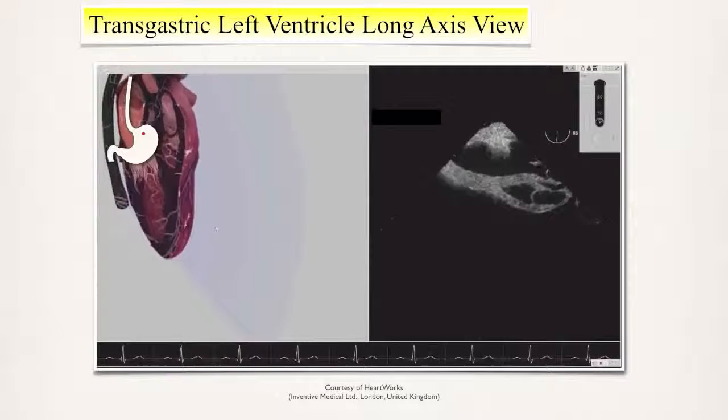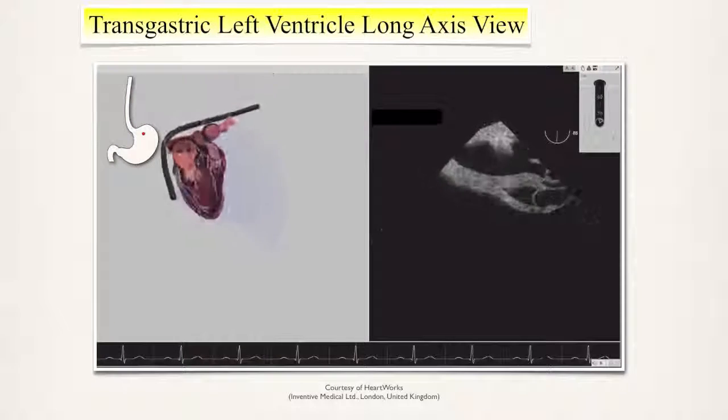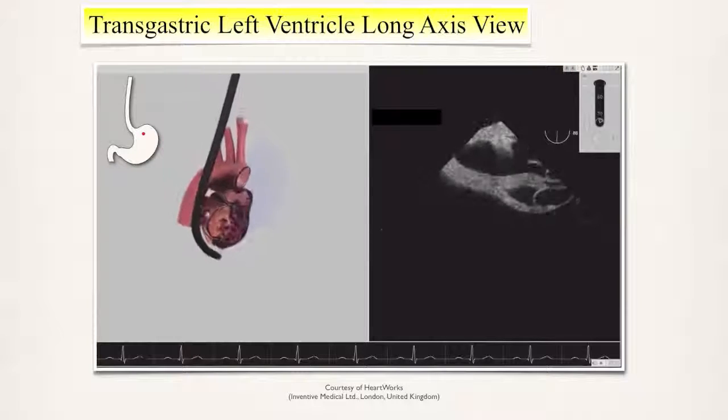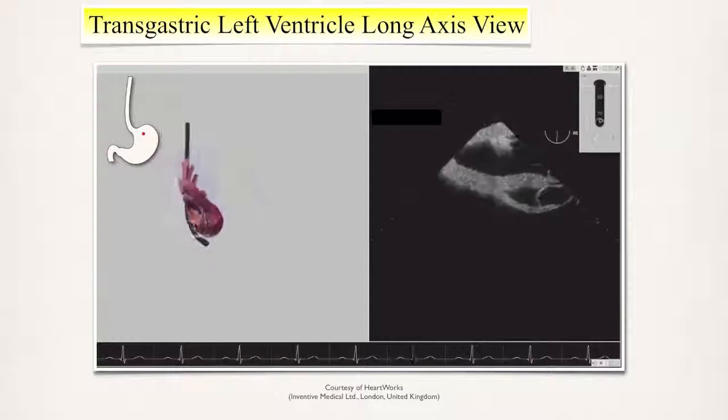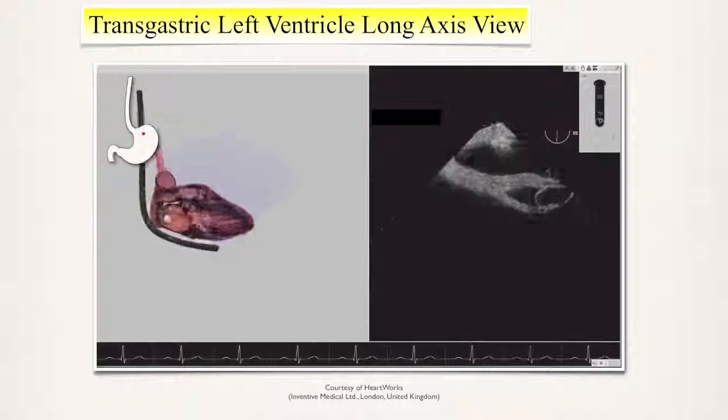After aortic valve replacements, there are often artifacts in the mid-esophageal views that limit the ability to see the valve adequately, so this view should be obtained to assist in evaluation as well.